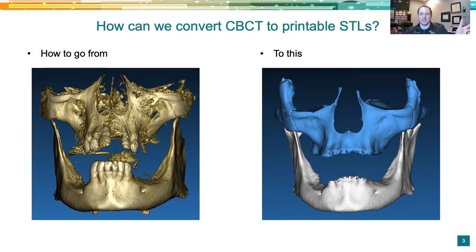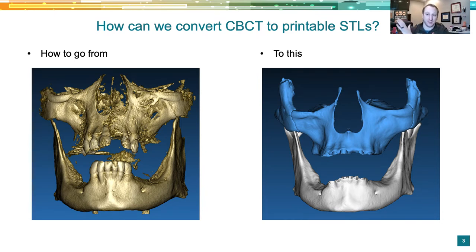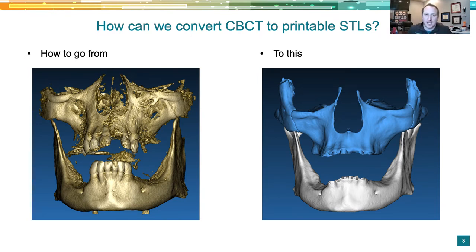How do we go from a CBCT rendering to a clean printable model or series of models? There are several ways — tedious inexpensive ways, all the way to non-tedious but expensive ways. Most CBCTs can give a general outline of a rendering based on Hounsfield units. You can adjust the slider to see bone, soft tissue, or other structures. But you can't just click a button and print that — you have to convert the rendering into a 3D printable file.